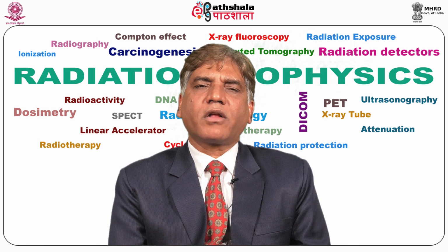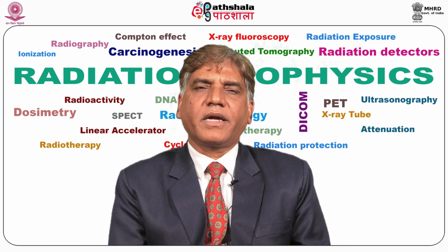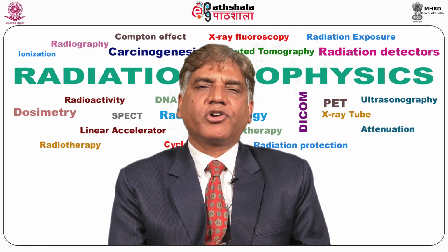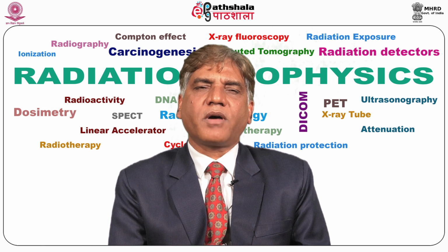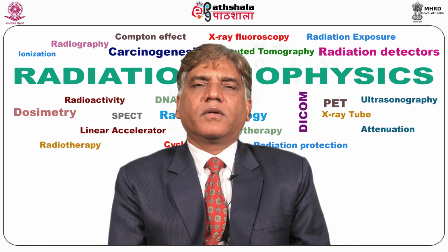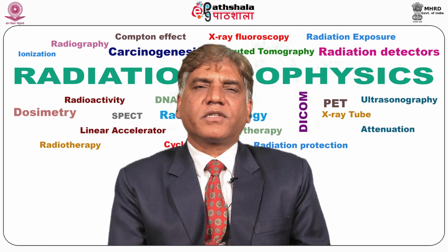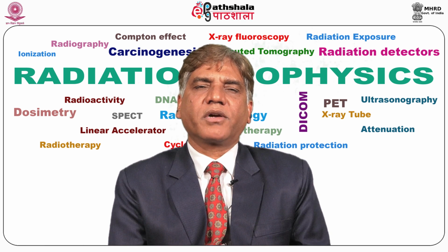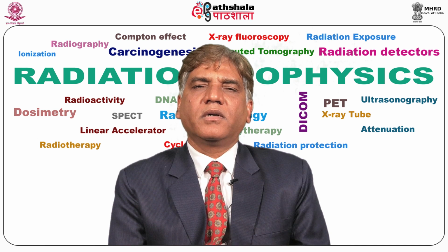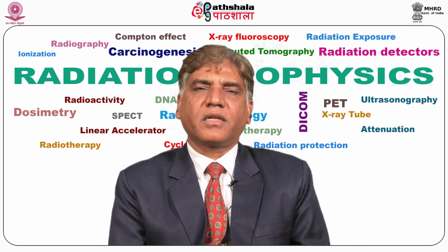The last part is the radiology information system, known as RIS. In modern digital radiology, in the Department of Radiology, the RIS forms the backbone which controls almost all aspects of radiology workflow. The RIS drives the workflow and transfer of information across the department. It deals with non-image, text based computed functions such as scheduling of appointments, and generation of bills and reports.